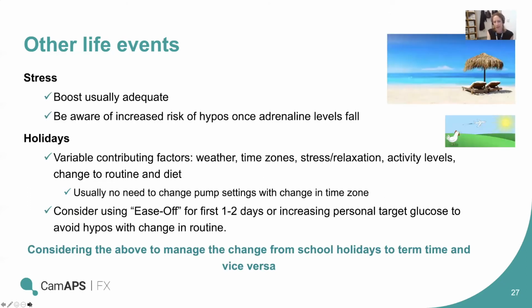So thinking about some of the other day-to-day life events and how closed loop can be used to help with these. So I think in our last webinar, Hood Tabit talked quite a lot about stress and how this can be managed most effectively. And I think in most situations, boost is normally adequate. Hopefully for most of us, stress is relatively short-lived, and so it can be managed with boost on for a few hours, thinking about work stresses and presentations, things like that, exams.